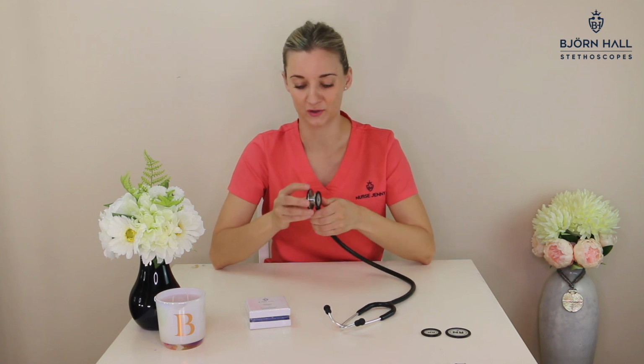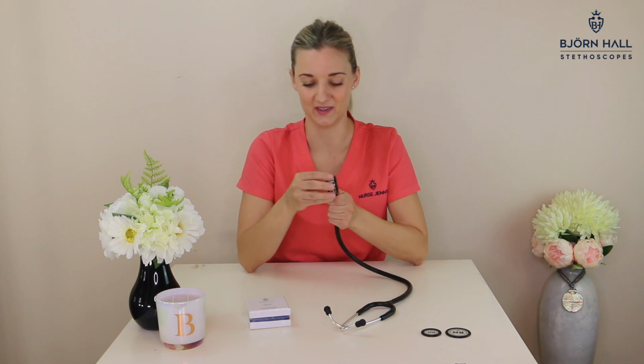So step 1 is removing the existing diaphragms of your stethoscope, and this can be a little bit tricky. Remember, you don't want your diaphragms falling off or sound escaping anywhere, so I've made them quite snug, but it is quite possible to remove and I'll show you how. If you have long nails though, you might want to get someone else to help you out with this one.